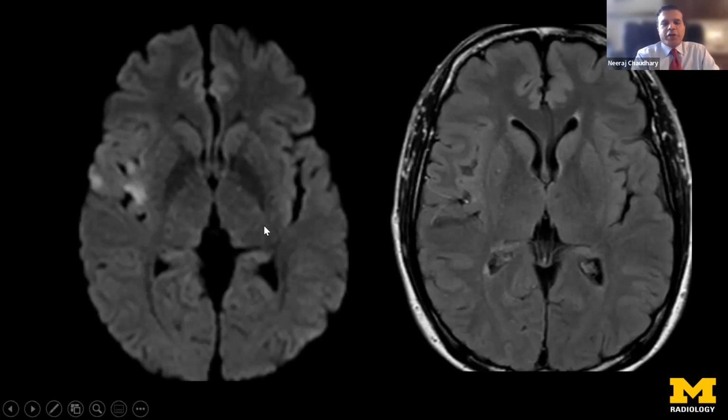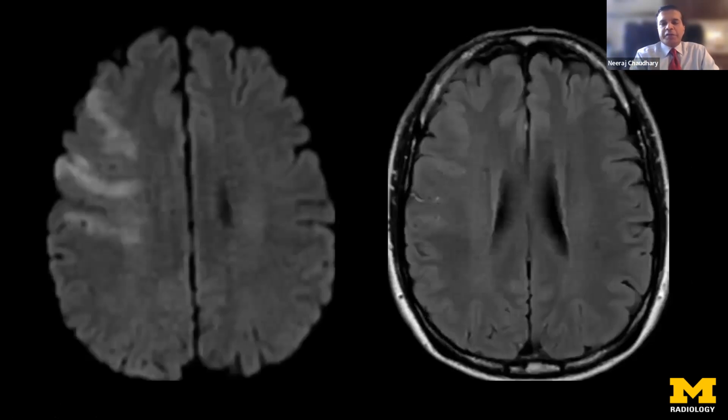This stroke imaging tells us that if the FLAIR signal has not become bright, the diffusion weighted abnormality can be reversed. So this is further up in the patient's right side of the brain, which shows diffusion weighted abnormality. But again, no corresponding FLAIR signal abnormality. You can see slow flow in blood vessels being bright in these sulcal small blood vessels, which is a fascinating pickup, and something for the radiology trainees and people on the talk to keep in mind: slow flow in a blood vessel can be bright on FLAIR.